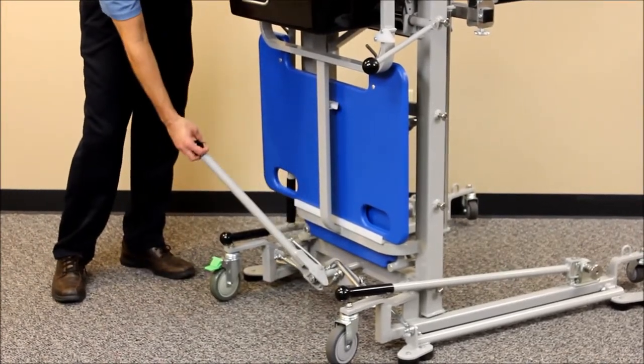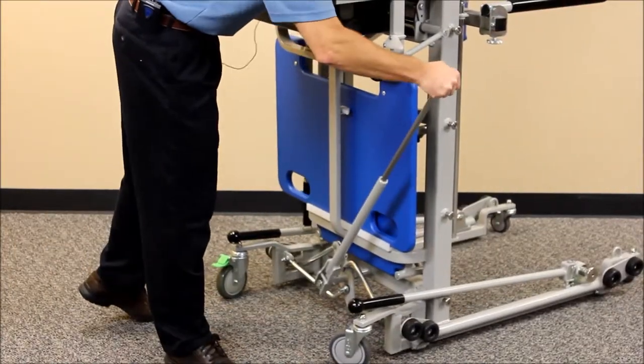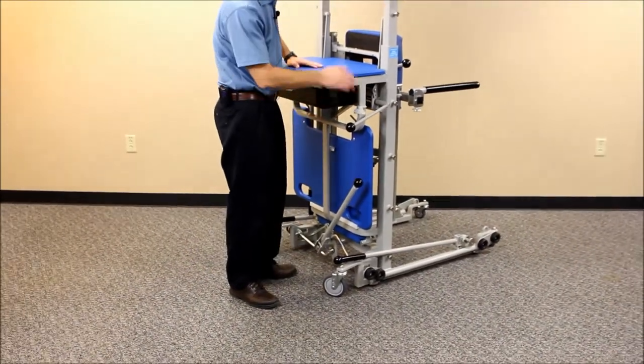To release it, just go the opposite direction — extend the lever and pull the other side — and make sure you lock that so the bars are in the full upright position so you can get through doorways easily.